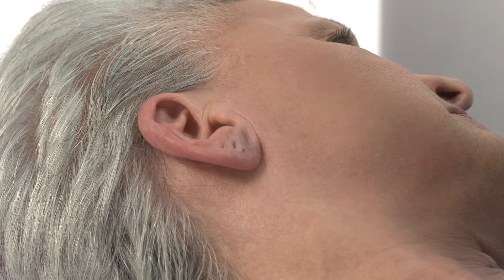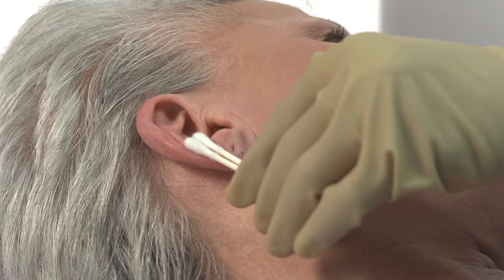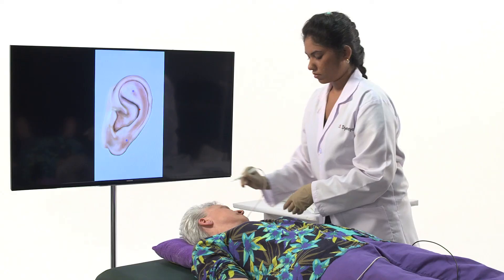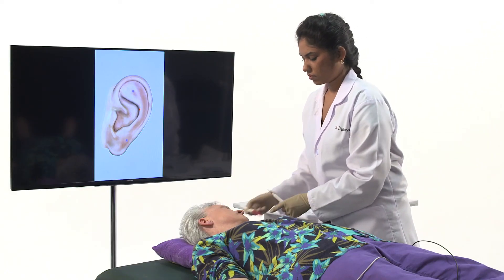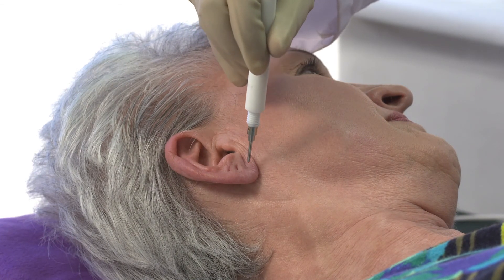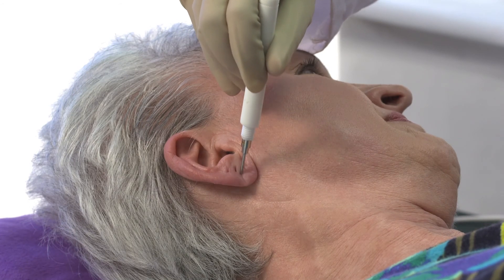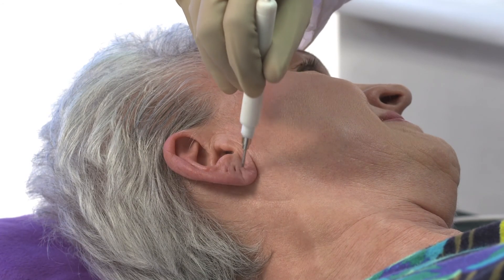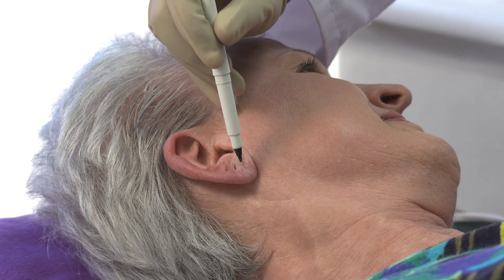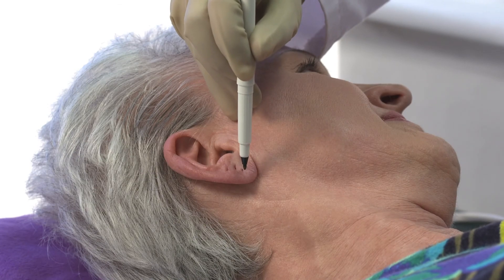Apply Prep and Stay to the area just cleaned. Prep and Stay extends wearing time, maintains excellent adhesion, and electrical contact. Locate the first needle by pressing the locator tip on the ear. A low-pitched sound indicates a poor location; a high-pitched sound indicates correct needle placement. Mark the point using a sterile or surgical marker. Repeat this procedure for the remaining needles.